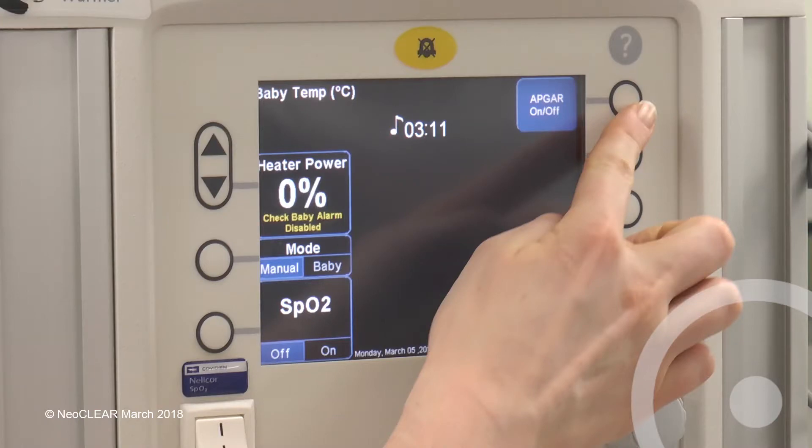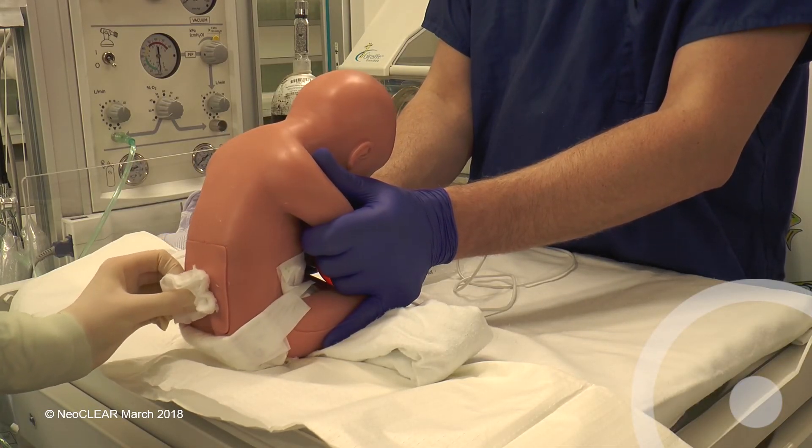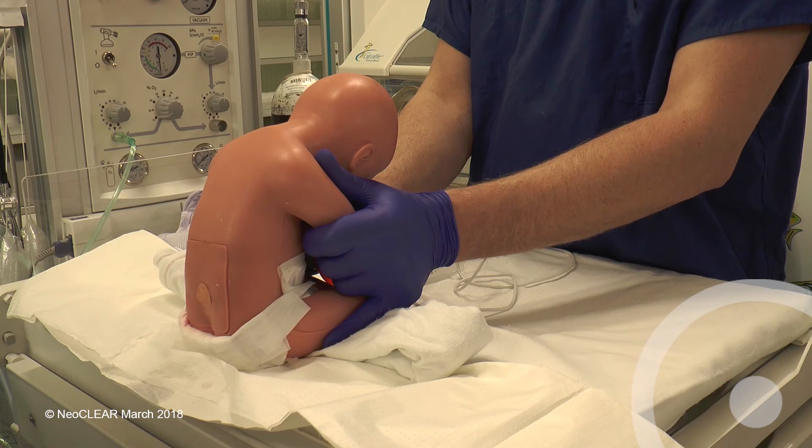Note the time of the end of the procedure once the needle is withdrawn if the first attempt has been successful, or continue timing until the end of the second attempt if required. Ensure no CSF or blood is leaking and apply a spot plaster or spray on dressing. After disposing of sharps and clinical waste, complete the case report form and update the parents.